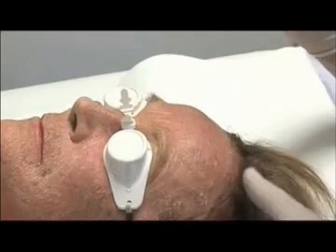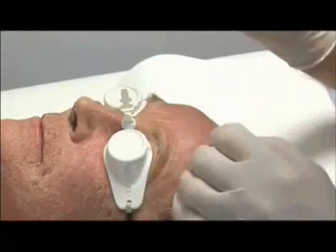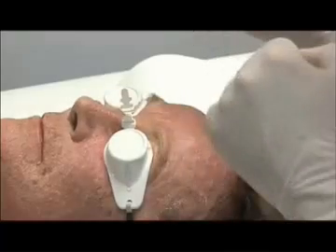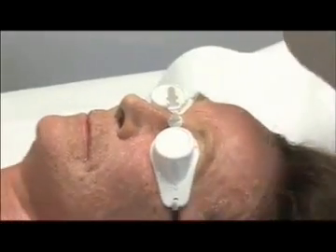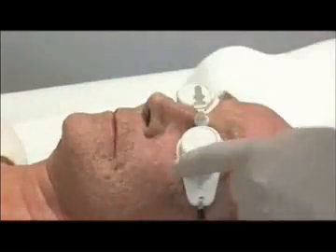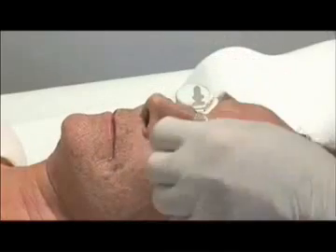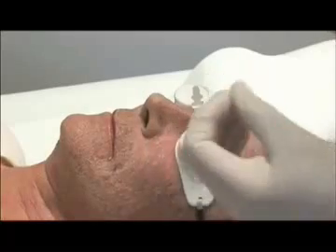The first passage had a vertical action of de-epidermalization, and the second passage will have a horizontal action of cutaneous retraction. In this way, the skin will stretch horizontally, and this is interesting for the perioral gridding. At the second passage, in the perioral area, the same intensity is applied as in the first passage, but we are more careful compared to what is usually done.